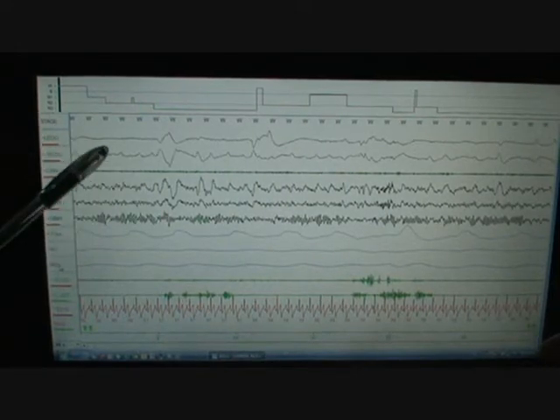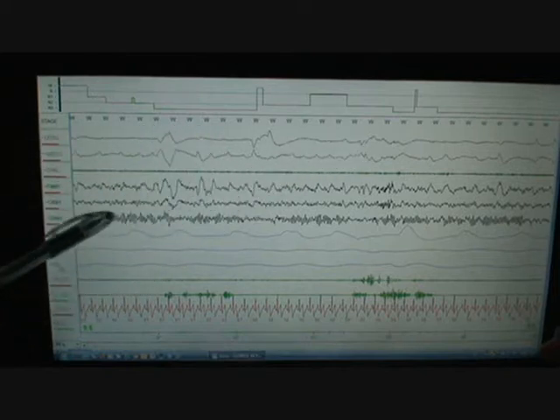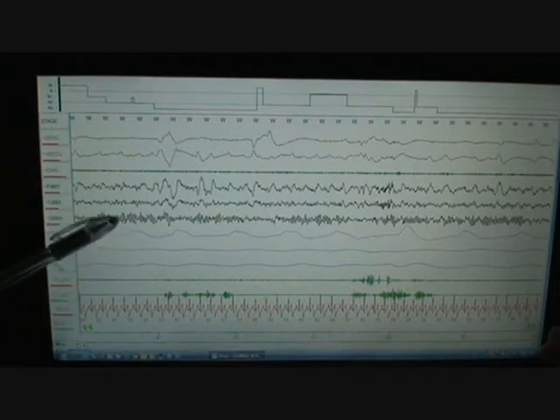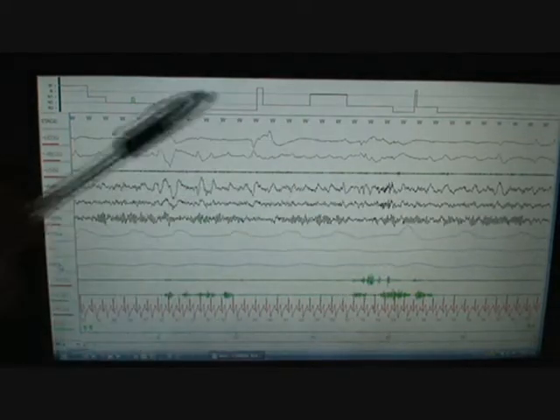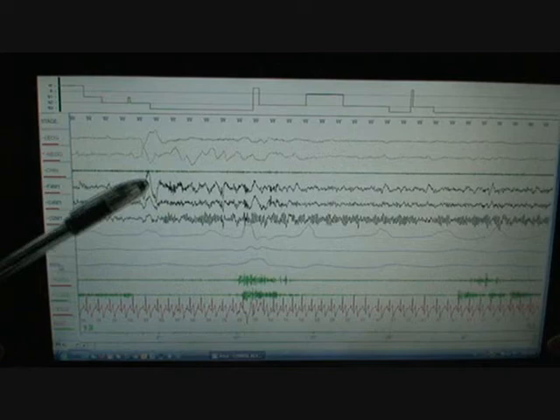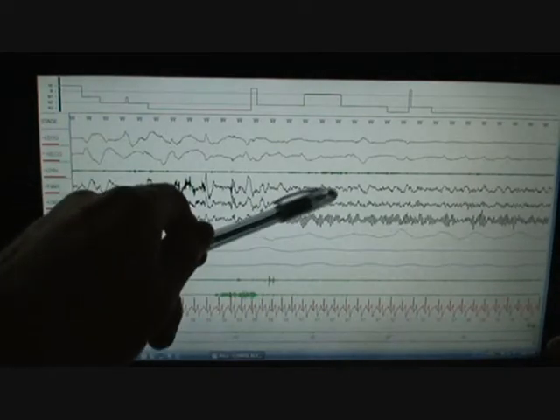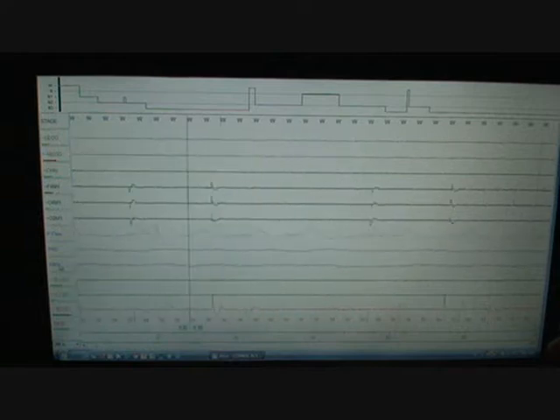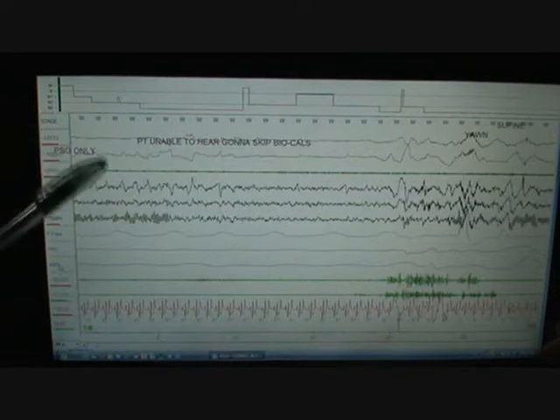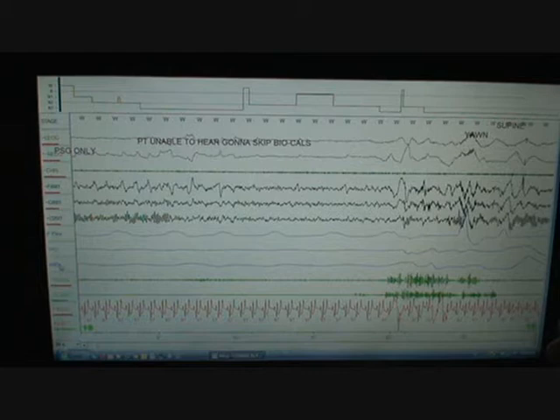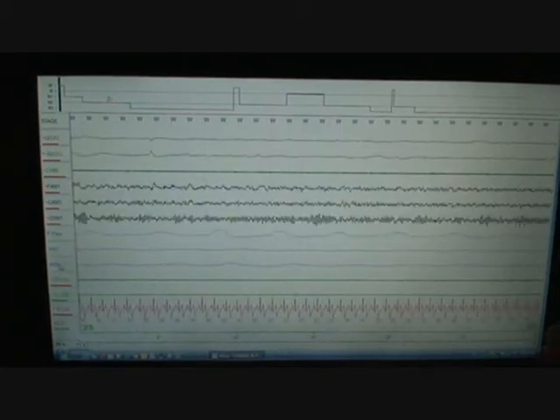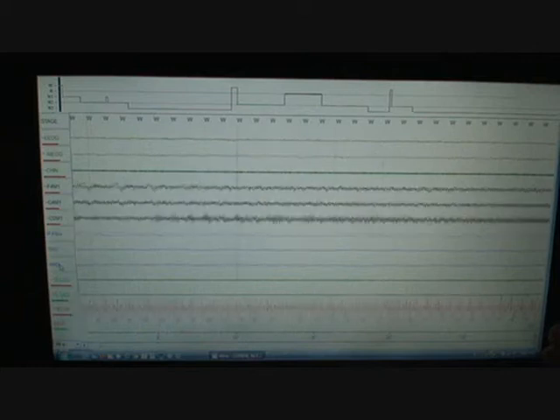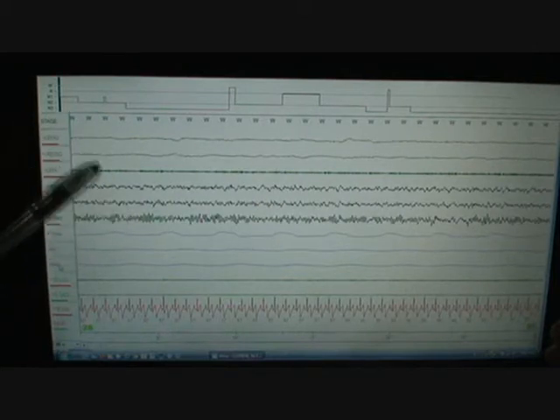So this person, they're awake, their eyes are closed, as you can tell, because this is alpha. Alphas with the eyes closed and this stuff shows up very well. It's eight to 12 cycles per second. It's pretty strong alpha. You can see in the central and frontal channels, it's a little more difficult to see.